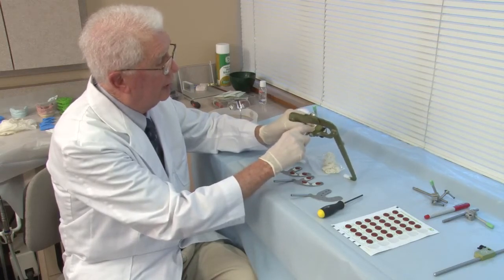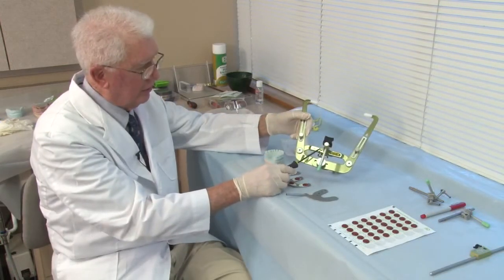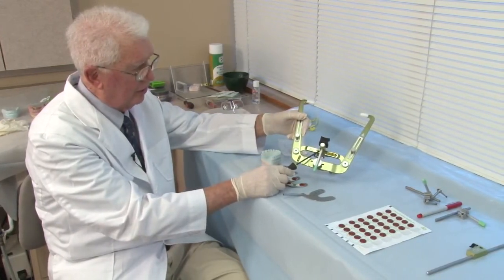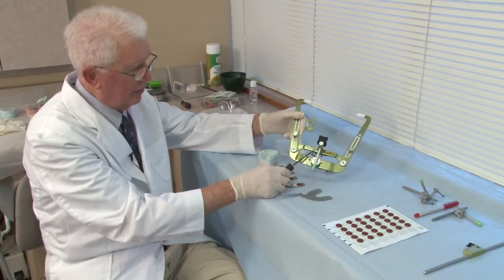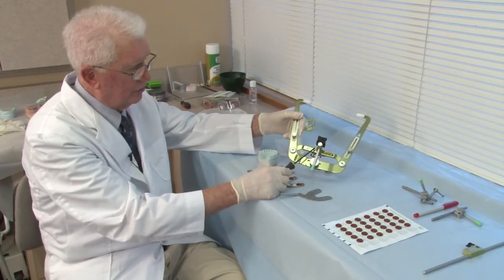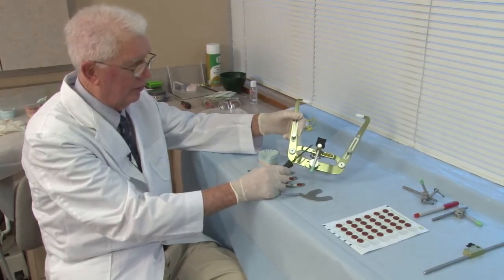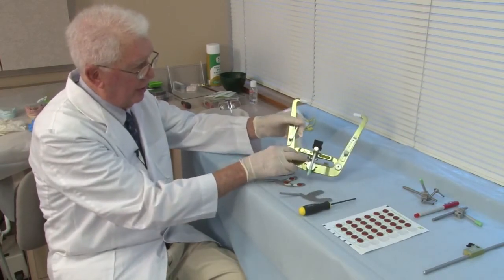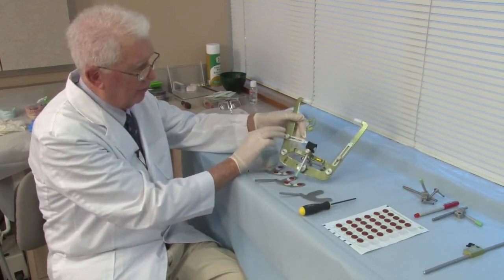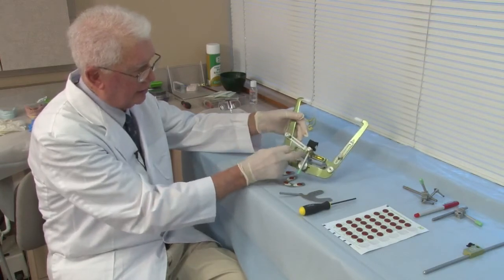Seat it all the way. We've seated the bite fork assembly into the ear bow, and as I said, this part now is even with the ear bow, and this will give us our third reference point, the vertical dimension in the anterior segment. And if you take the orbital pointer and loosen it and move it over there, you'll see that the pointer comes out exactly the same level.